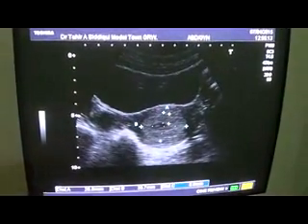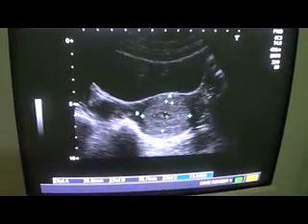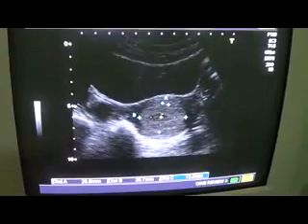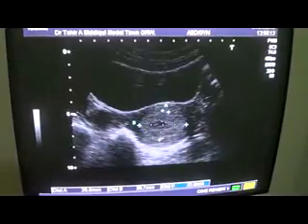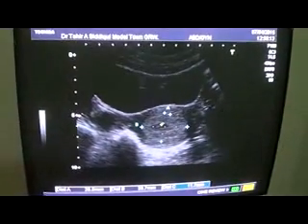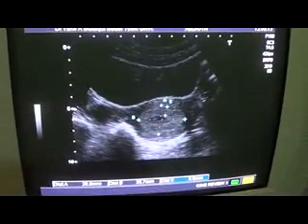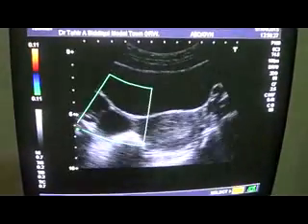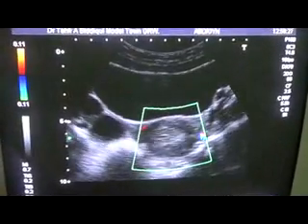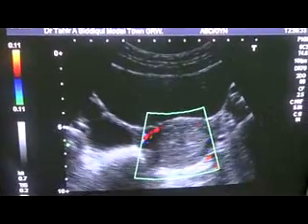The thickness of the echogenic rim around the fluid in the centre of this solid area — this echogenic rim is consistent, it measures approximately 8.0 mm. And the other thing is that in this endometrial canal, there is no significant blood flow seen.